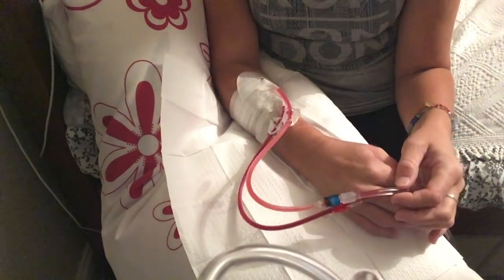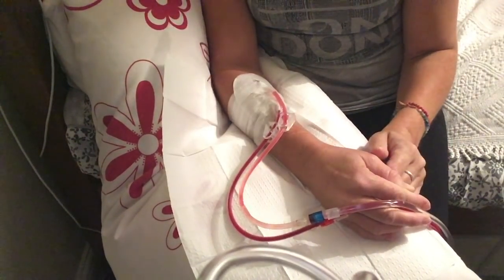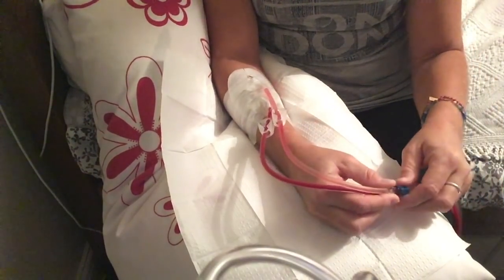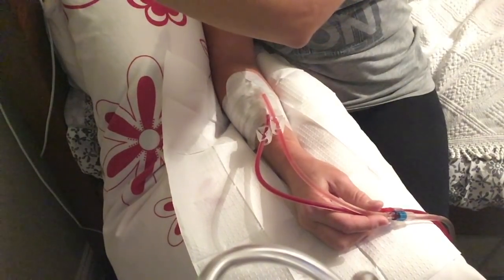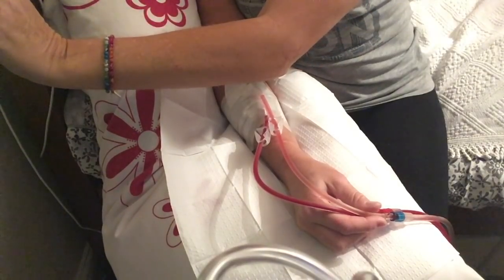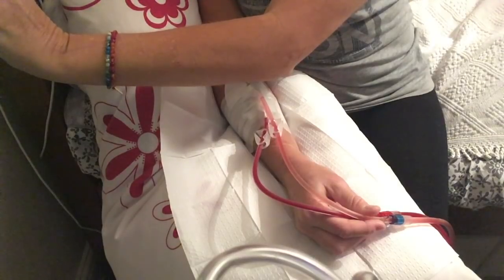There are always a couple of tiny micro bubbles in the venous line, which is kind of inevitable, although I try to make sure I've flushed as many of them out as I possibly can. I can now tell the machine to start ultrafiltration, which means start removing fluid. I've put it into dialysis mode, so it's now starting the treatment properly and turning the blood flow speed up.